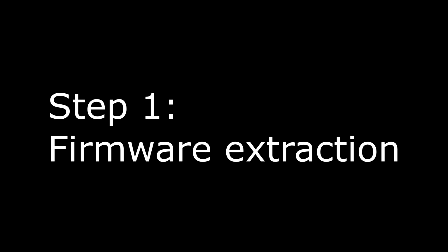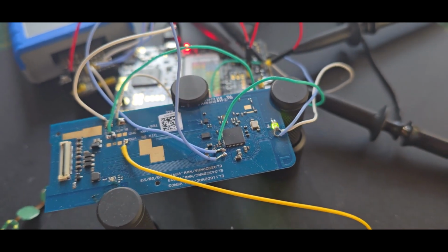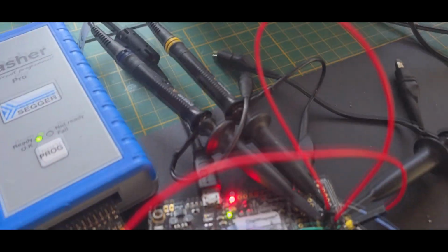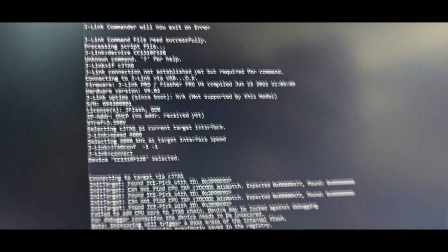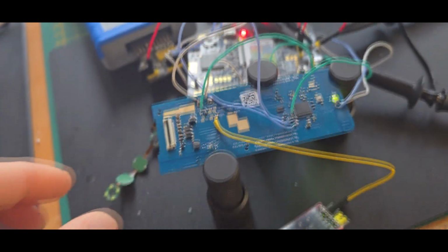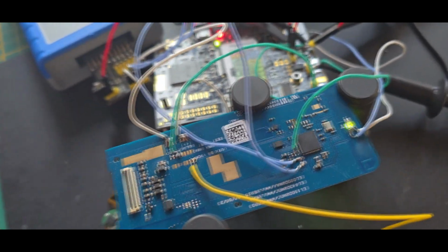Maybe we are successful. So, while we only got one of the pill camera PCBs, I started on using a different PCB to just try to glitch it with the help of a bit of ChipWhisperer toggling and UART printing of the current state. While glitching, there is a custom firmware running on it, and every time it successfully glitches, we can also observe it. This is just to find out where to glitch.